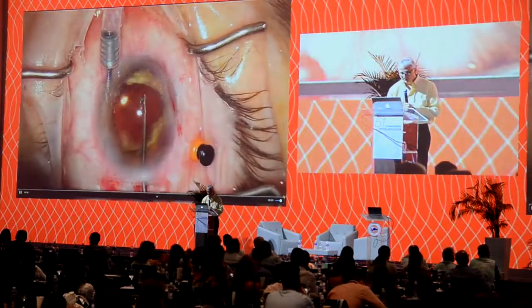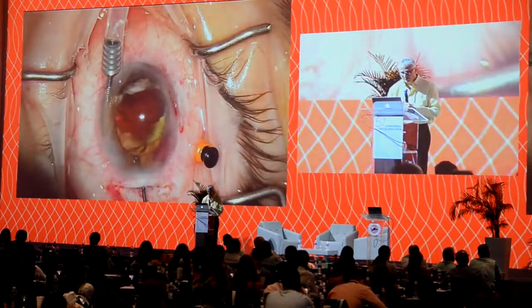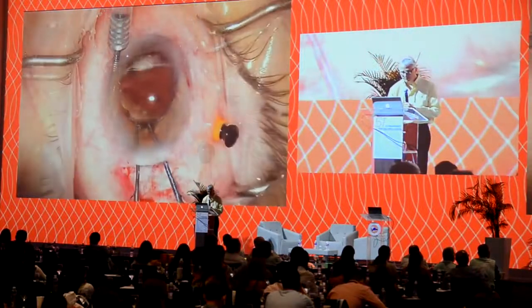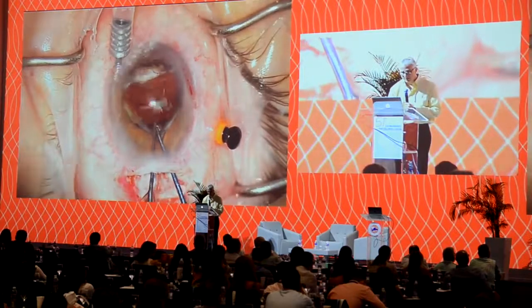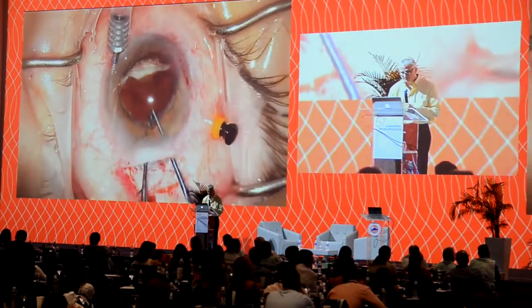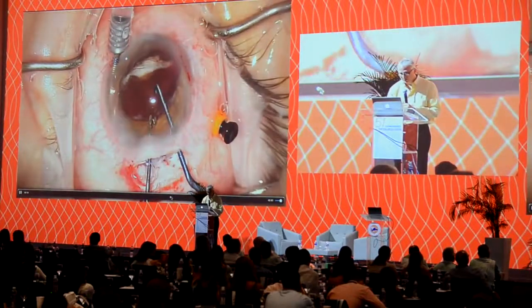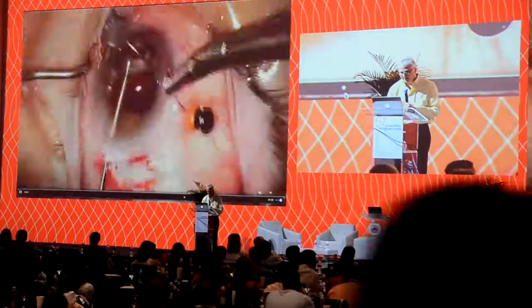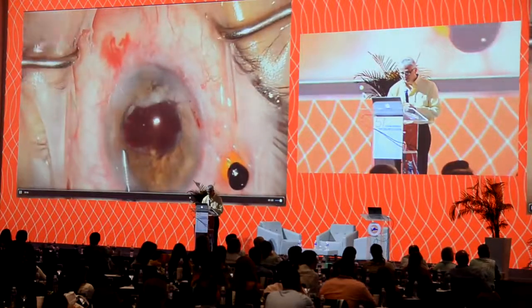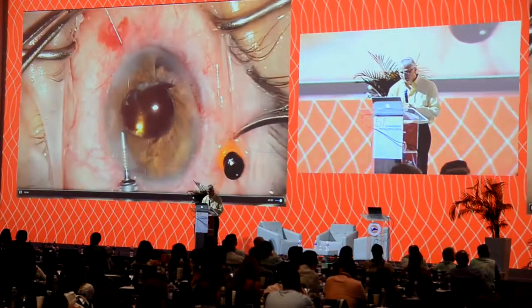We slide our 3-piece implant lens in, and we're just going to gently capture the optic through that opening, so the round haptics are in the sulcus, and the optic, we're going to retract the capsule to tuck it underneath, and the optic is into Berger space. Ideally, we're then able to center on the capsular bag. We use that technique that Ike was showing you to suture the iris, which works really super well, and it's very easy, and it works every single time.